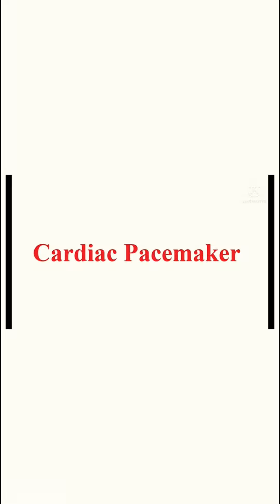A pacemaker is an electronic device that provides electrical signals to stimulate the heart muscle. A pacemaker is an electronic device used to pace the heart when the normal conduction pathway is damaged or diseased.